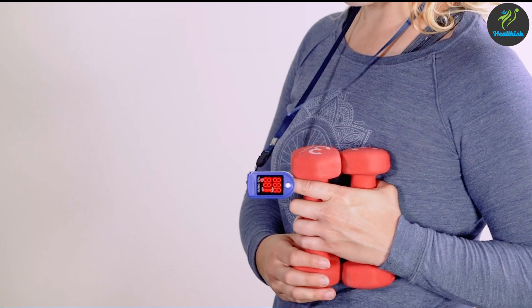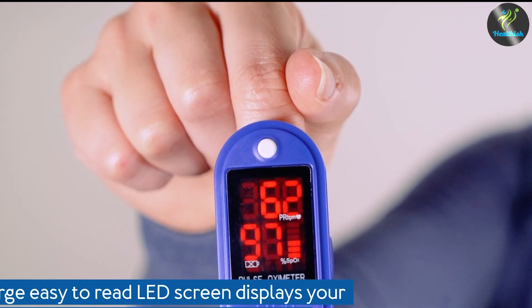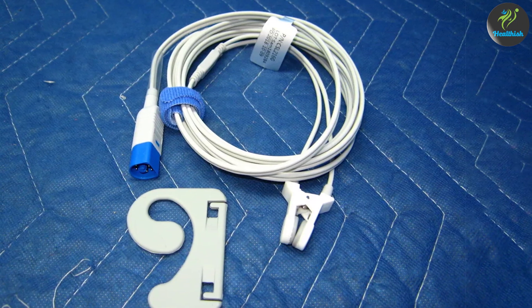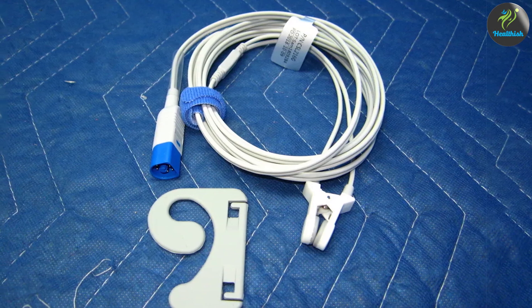Portability and size are important factors, especially for on-the-go use. Finger pulse oximeters are typically smaller and more compact, making them highly portable and easy to carry in a pocket or bag. Ear pulse oximeters may be slightly larger due to the earlobe clip design, but are still relatively portable.